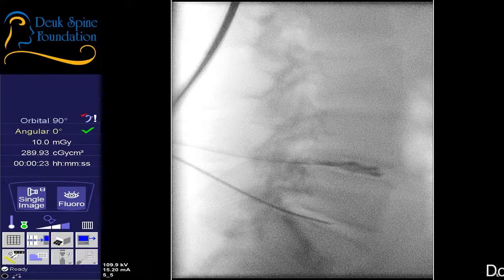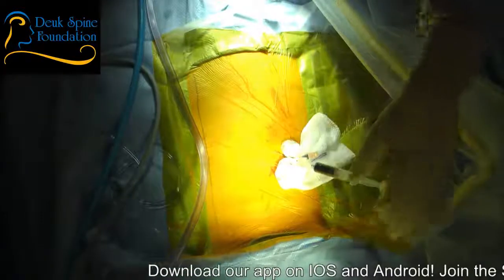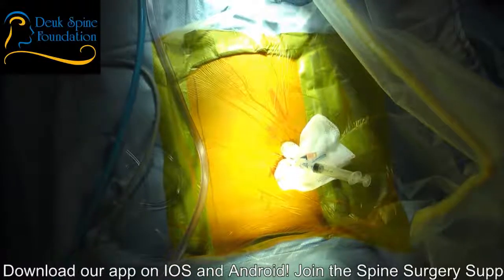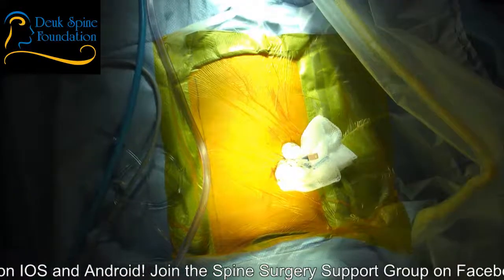I'm going to put you to sleep in just a minute now. I need your help just for another minute. So I didn't tell the patient I was injecting anything in their disc, and you all saw how he reacted, I hope. He really felt a lot of discomfort, because I tested the L4-5 disc. L5-S1, it just comes right out. Okay, you can go to sleep now. When you wake up, we'll be done.